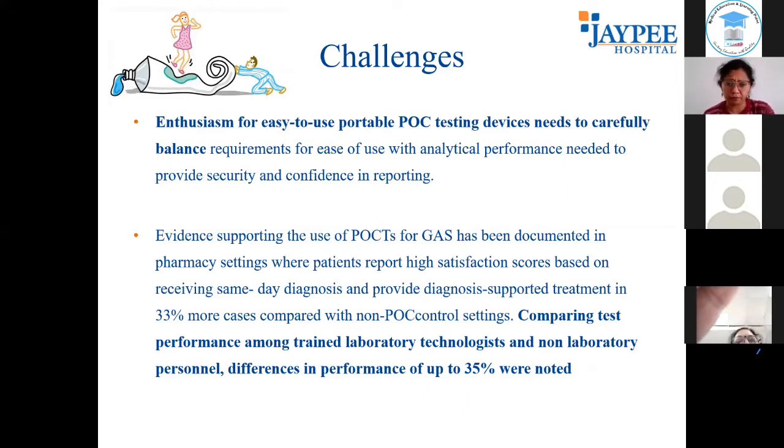Even then, comparing the test performance among trained lab technologists versus non-trained is important. I'll give you an example of a simple lateral flow assay, which I faced in my own lab. In the lateral flow assay, the time the manufacturer had mentioned was 15 minutes. The technologist who was performing it was a new technologist, a trainee technologist, and he did not follow the 15-minute protocol.